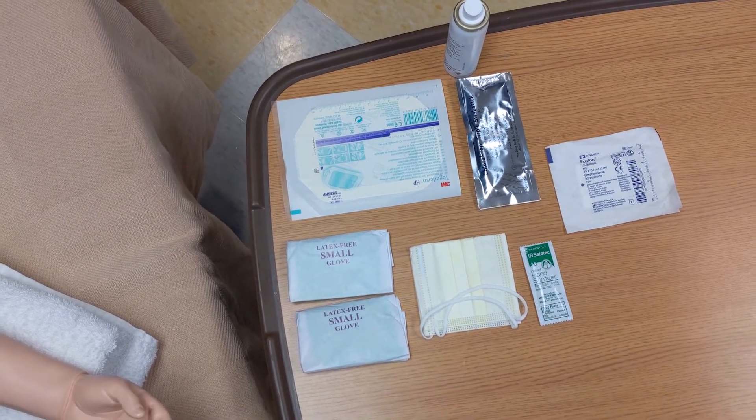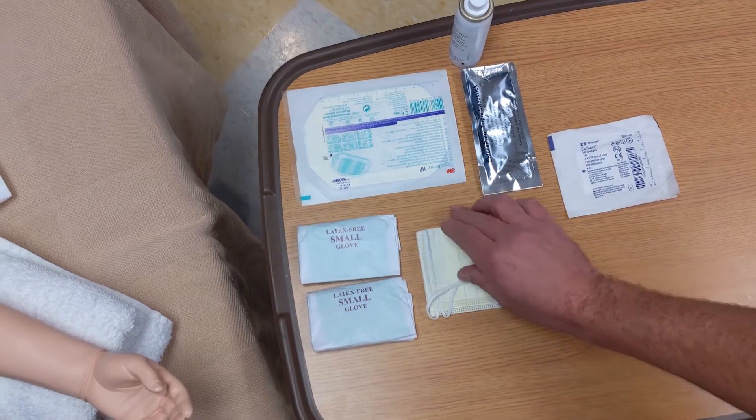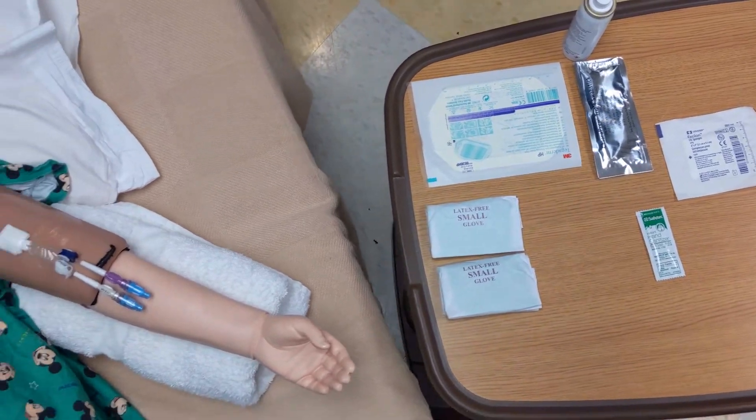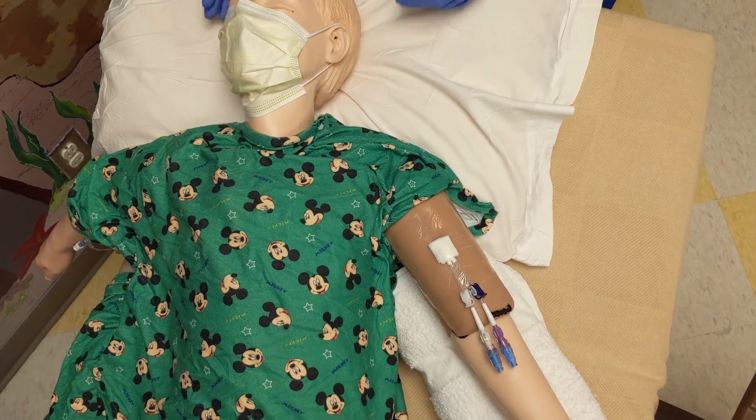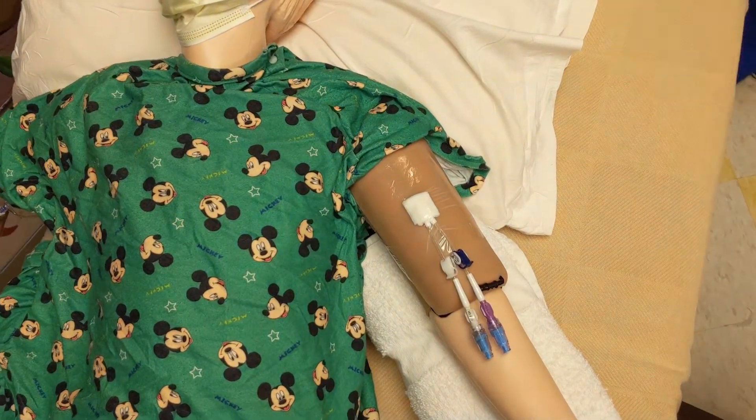The first thing you want to do is put a mask on yourself, the person assisting you, the patient, and anyone else within three feet. Once you have put your mask on, perform hand hygiene.